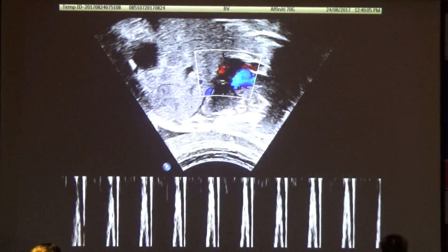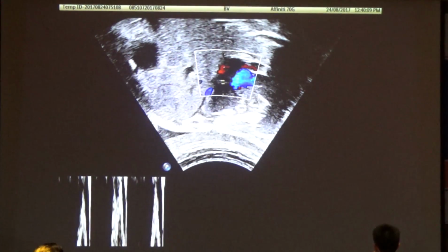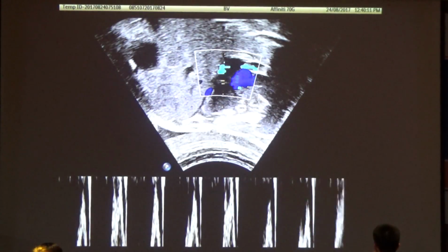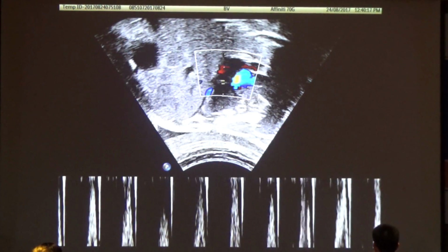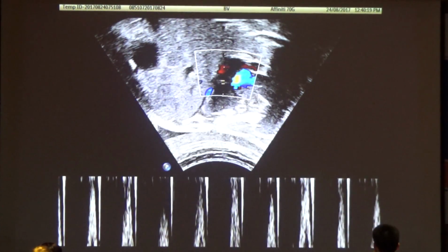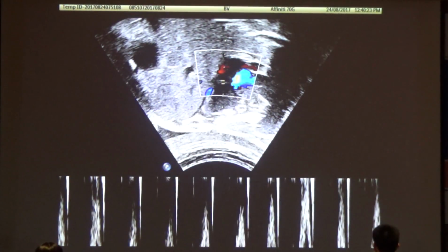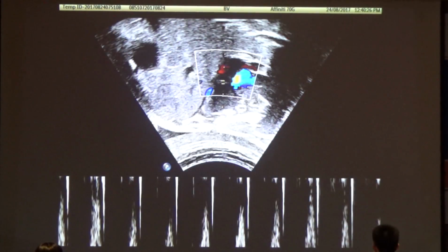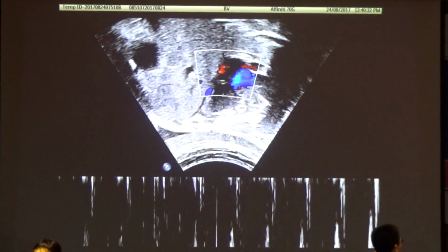No, but what we want to see is the back. We want the baseline up, eh? Yeah. The baseline, there's a baseline on the color. I want just make that thing right for me here. Put that in the middle. This machine is confusing. It was not designed by cardiologists, that I can guarantee you. It's designed by some idiot in Washington.